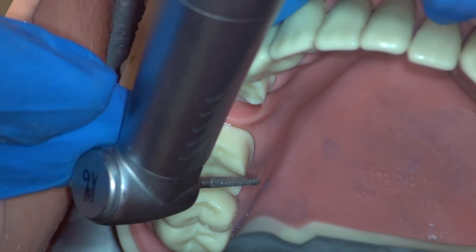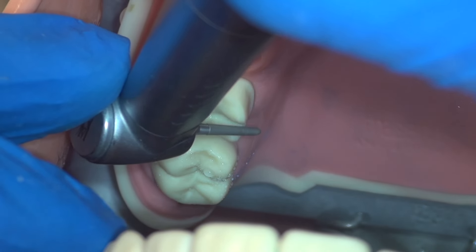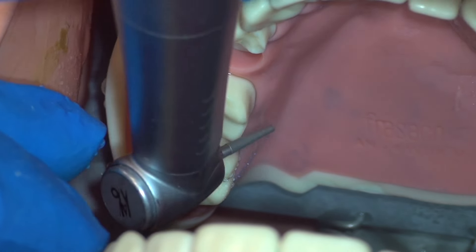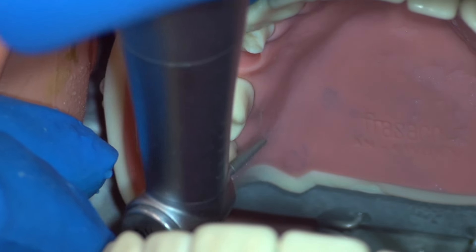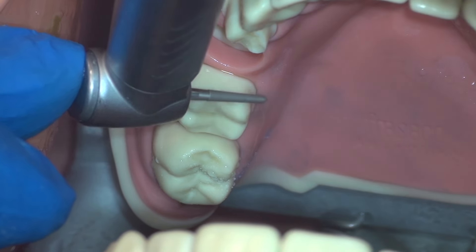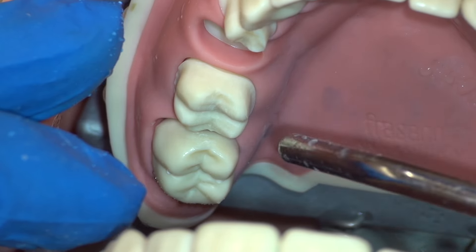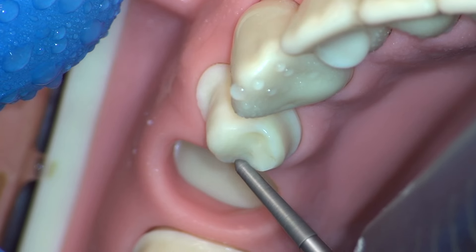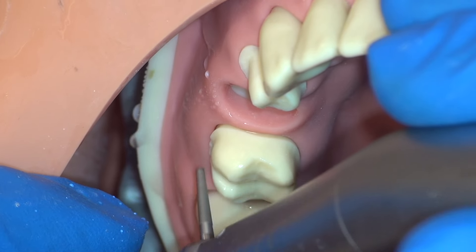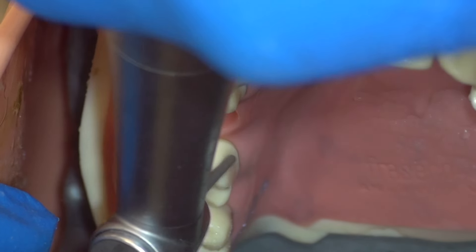Immediately after our lingual reduction, we'll see that the cusp tips are very sharp on the lingual occlusal aspect, and so we'll go ahead and smooth those now with the red diamond bur, working in a slow and controlled manner at slow speed. Remember that for smoothing, we should work from one plane to the other with small rotations between each stroke, starting parallel to the occlusal plane, and then rotating until we are parallel with the axial wall. This is the best way to make a very smooth, very rounded preparation. We will now work our way around both preps, smoothing them in this manner, working from one plane with small rotations until we are parallel to the other plane.